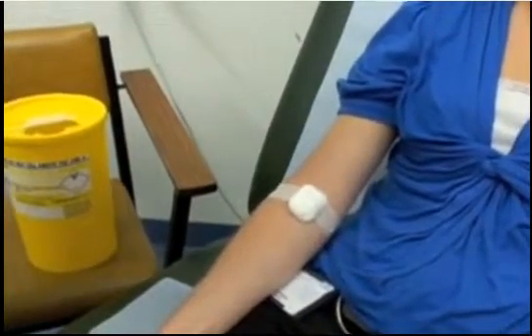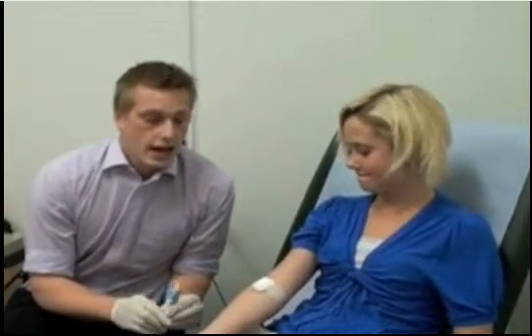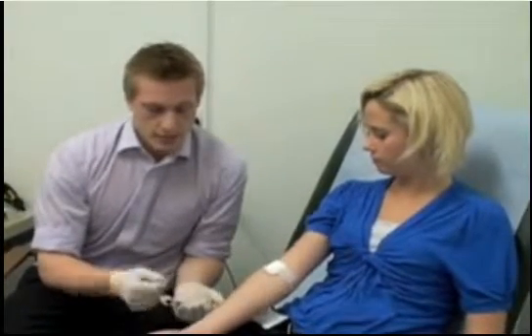Place cotton wool over the site, carefully withdraw the needle, and immediately dispose of it in the sharps bin. Ask the patient to press down, then tape the cotton wool in place. Thank the patient. Take the blood bottles, ensure they are correctly labelled with the patient's details, place them in the correct request forms, and send them to the lab for analysis.